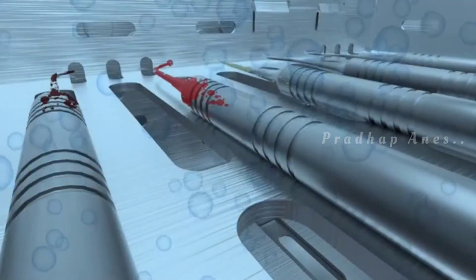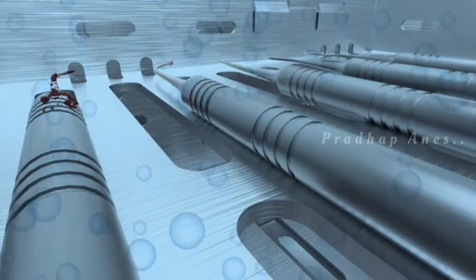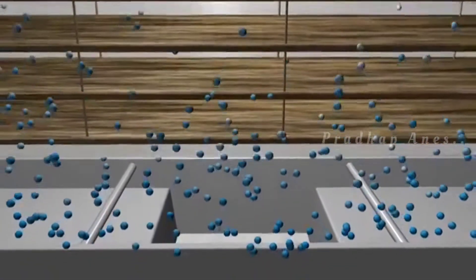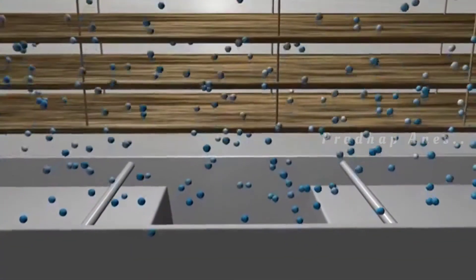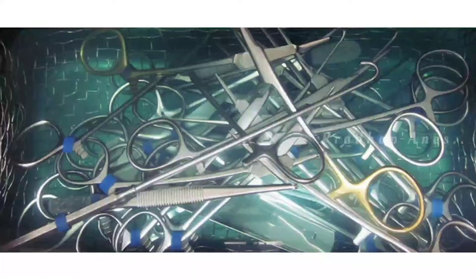Working principle: Ultrasonic cleaners work on the principle of cavitation, which means the formation of bubbles in a liquid. Ultrasonic transducers create billions of minute air bubbles in an ultrasonic cleaning solution. These air bubbles implode with violent force when they come in contact with objects placed in the solution, and strip away contaminants without damaging the objects.